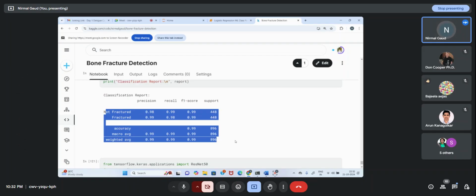All my architectures failed, but the Xception architecture, which was a very simple architecture, worked. I just took Xception and added a few layers: global average pooling, Gaussian noise, batch normalization, dropout, just to prevent overfitting and to give the model experience of some outside data in the form of noise for good learning. So training 98, validation 98, testing 99. This is the successful architecture. I got it here.